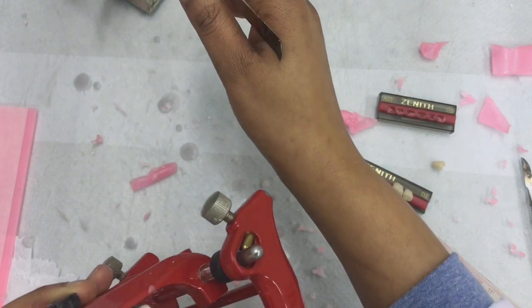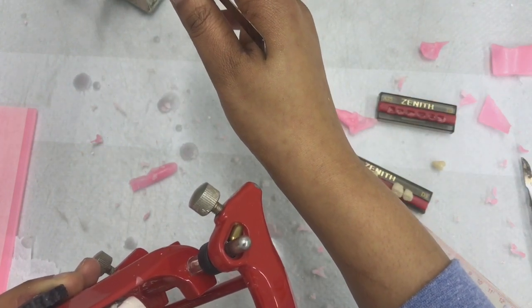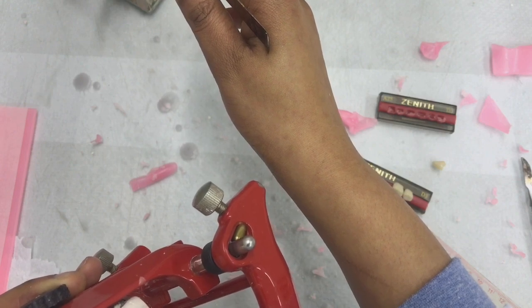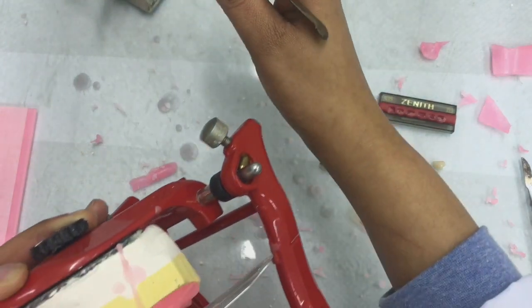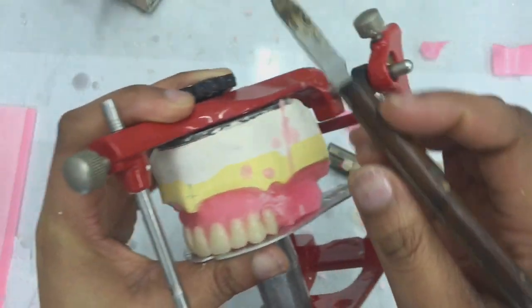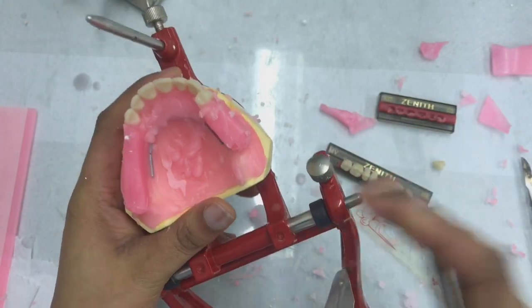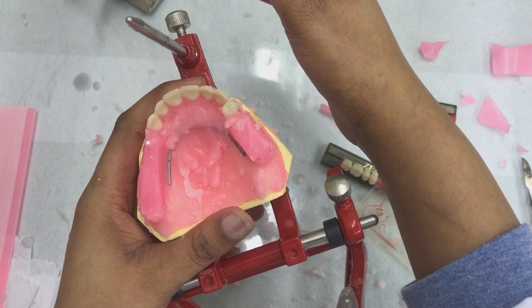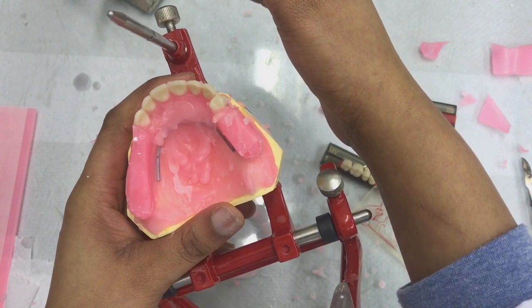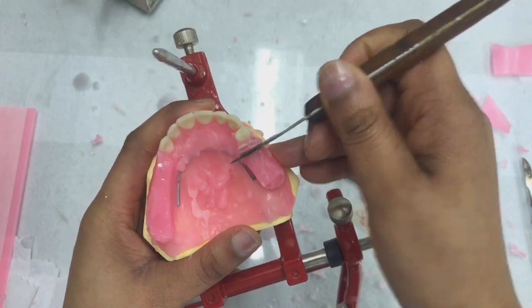So I'm going to move on to my second premolar. With the second premolar, both the cusps need to be on the occlusal plane table. Again, when I will be positioning the second premolar, I will try and align it with the imaginary line that starts at the center of the canine's cingulum and ends at the 2 millimeter distal line at the back of the model.